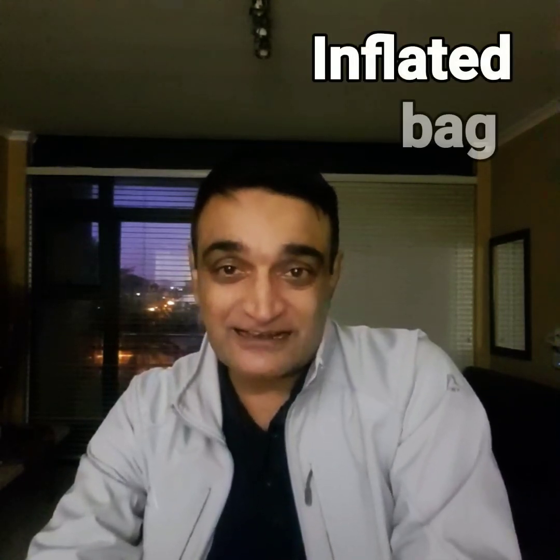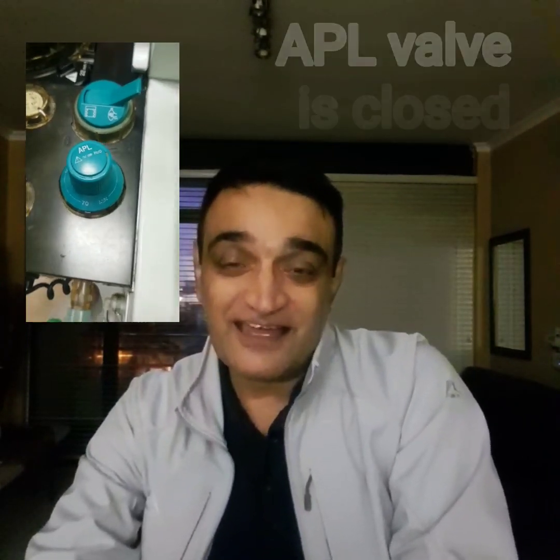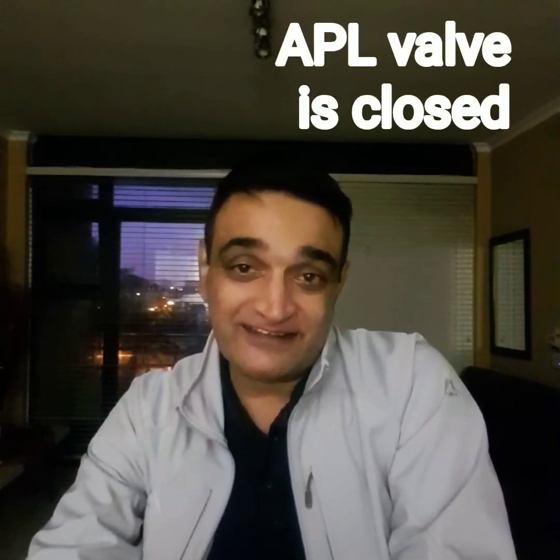And when it's inflated or about to burst, it can tell you that the APL valve is closed, and that can make it very, very difficult for the patient to breathe. So always hold your reservoir bag and look at it, because it's your friend. It will help you and it will prevent you from any mishaps.